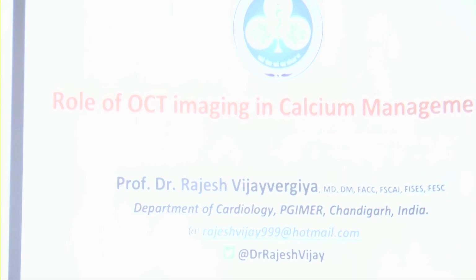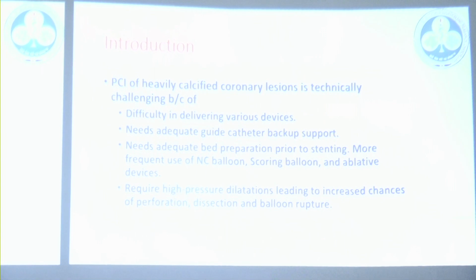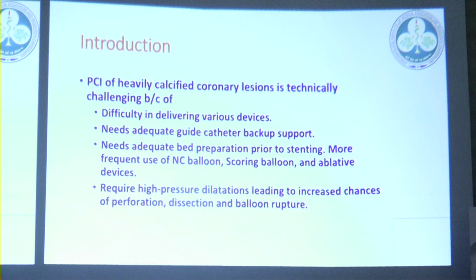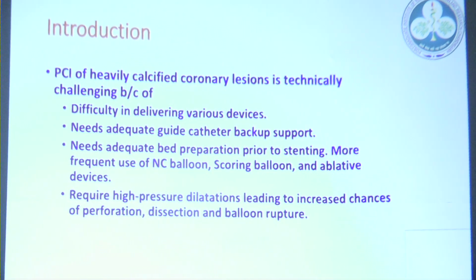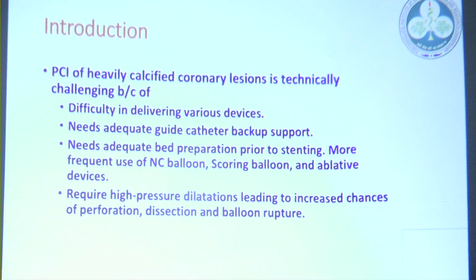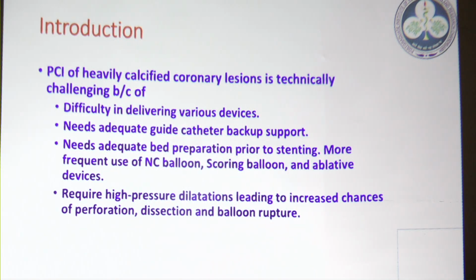My topic of the talk is the role of OCT in calcium management. As you all know, PCI of heavily calcified lesions is technically challenging because there is difficulty in delivering various devices and it needs adequate guide catheter backup support. There is a need to have adequate bed preparation prior to putting a stent across, which requires more frequent use of NC balloons, scoring balloons, and various ablative therapies.